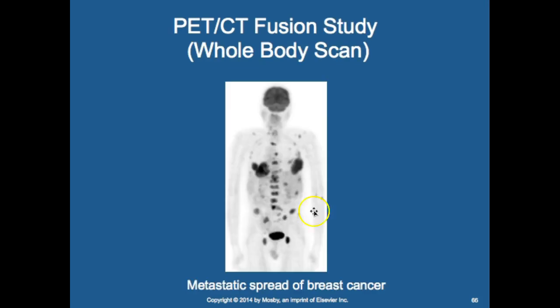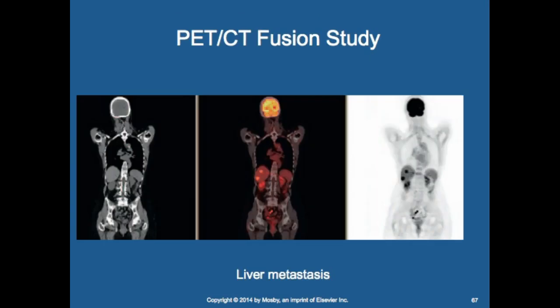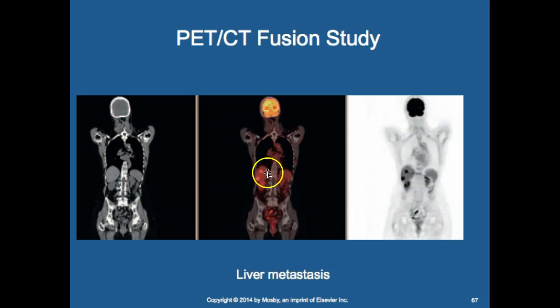In a fusion whole-body study for metastatic spread of breast cancer, we take the CT scan and the nuclear medicine scan and fuse them together to see hot spots within the liver. When it's hard to tell exactly where disease is, we can scroll through the CT to see the extent of disease within the liver. And that concludes the nuclear medicine lecture.